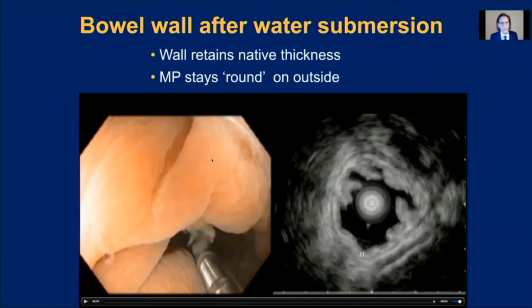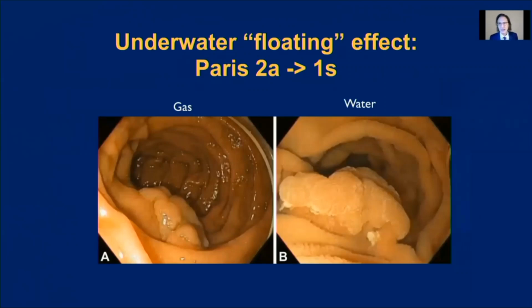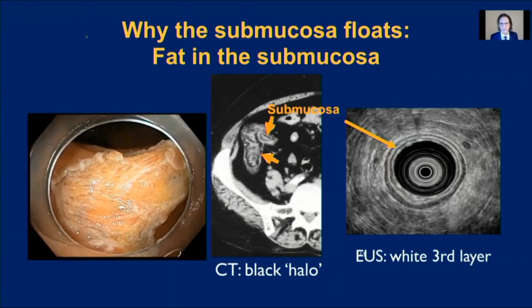And obviously one would be normally concerned about perforation. However, the MP, when we look through the wall, is intact. So we get this floating effect when we submerge the lesion underwater. So here with gas, this looks like a Paris 2A, a flat lesion, but underwater, it souffles up and looks like a 1S lesion. And really, when you look at this, you would think that a submucosal injection had been performed. Why does the submucosa float?